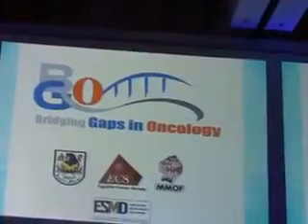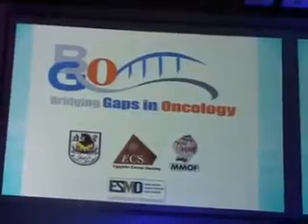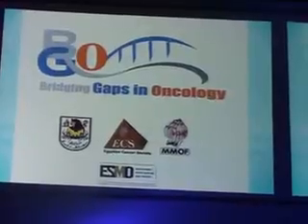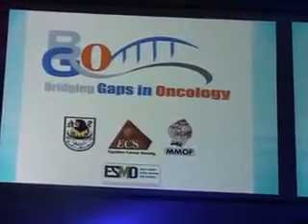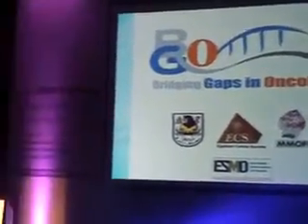Actually, the PET MRI is a new technique. It's not available that much in Egypt itself, even starting to evolve in Egypt now. But basically, when we talk about the tumor, we talk about two things: the size of the tumor and the extension. And those are the methods that we see in MRI, and it's quite obvious that we can stage well by MRI. What about the activity? The activity is important, but it's not important for accurate staging, except when you talk about lymph nodes. So lymph nodes have always been the debate. If we talk about small lymph nodes that look like benign lymph nodes, and then turn out after surgery to be malignant, this is the defect that we face in diagnostic radiology.